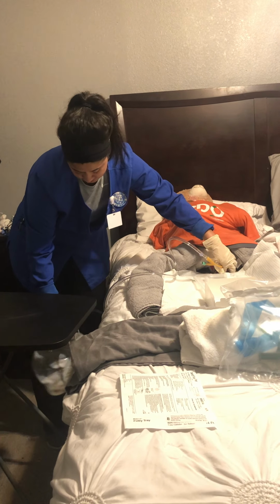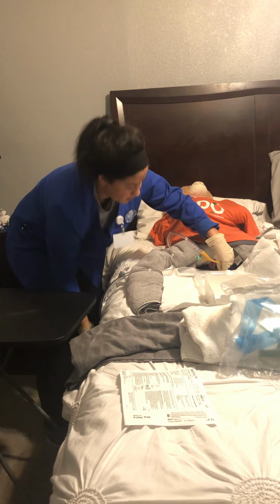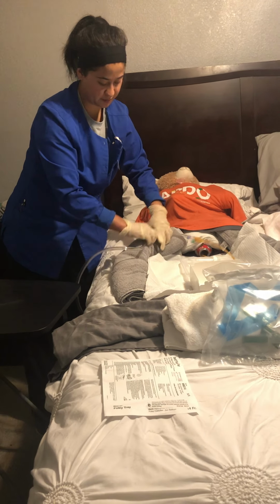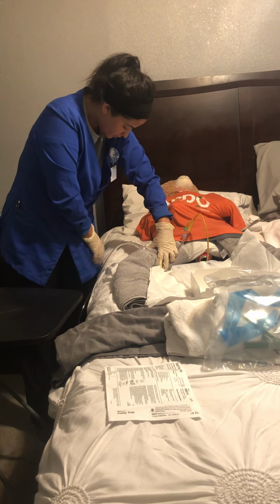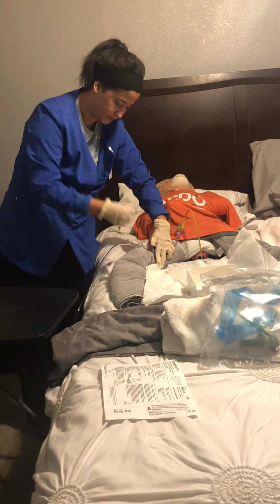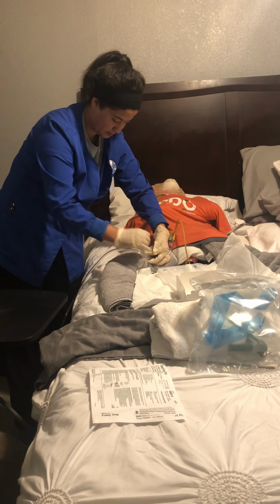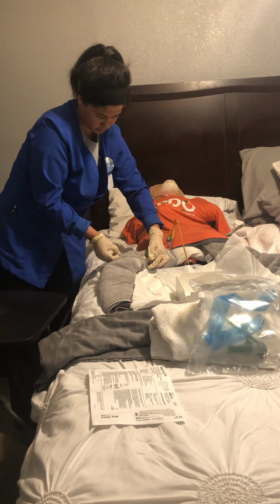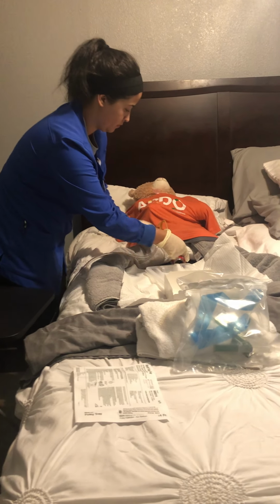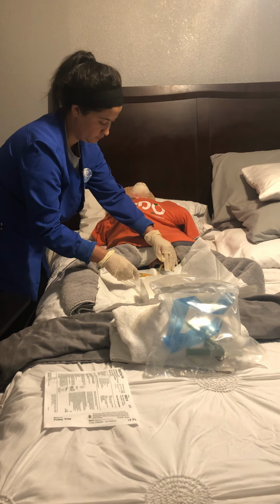I would then place it under there, or clip it to the bed rail, and I would secure it to the patient's leg with some tape that I have in the wrong hand. And it's kind of not working for me.